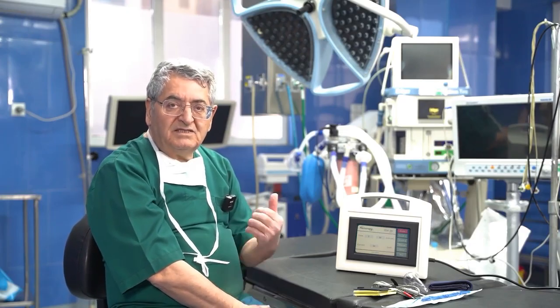The results are also very good, provided that the electrode is properly placed and positioned correctly on the pile. After the procedure, the patient does not experience any particular pain. We can use up to 30 milliamps with anesthesia, or more specifically with spinal anesthesia, and the patient is comfortable, though the treatment may take a few minutes longer.